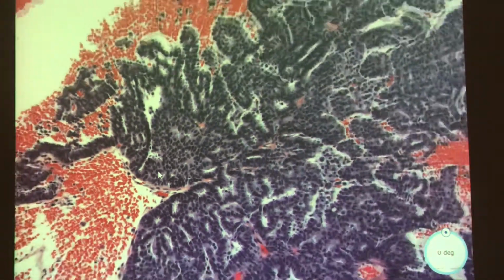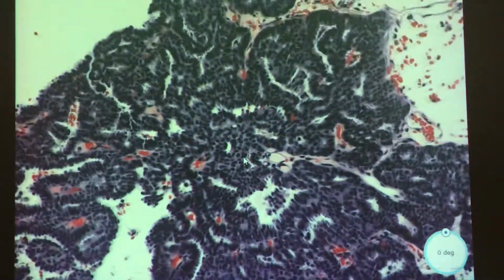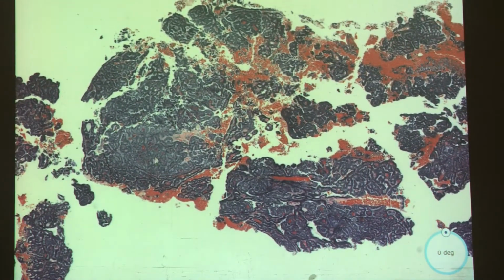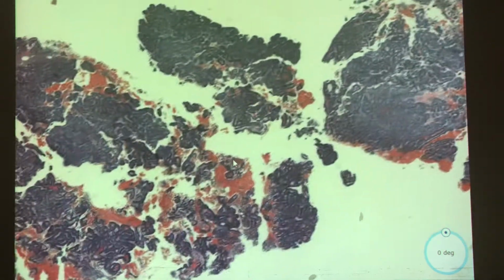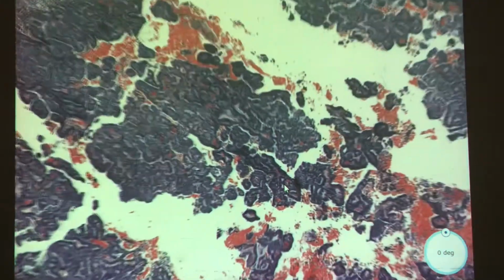And what's the overall pattern? So, blood vessels. So, papillary. Perfect. Yep. So this is like a papillary DCIS. It's at least huge. Oh yeah, they can be. Remember, you can have DCIS that can be like 10 centimeters of breast involvement or more. But yeah, like you said, this is a biopsy, so we can't exclude that there's some invasion somewhere.